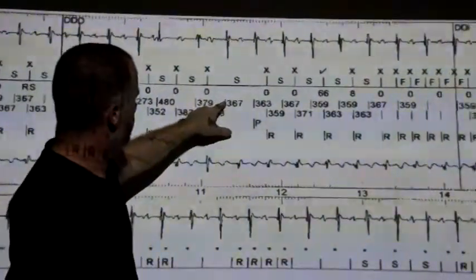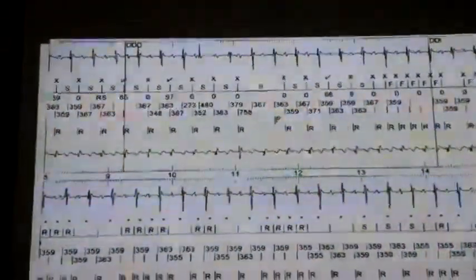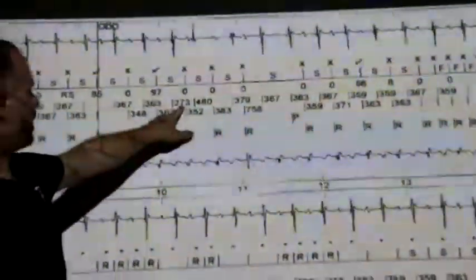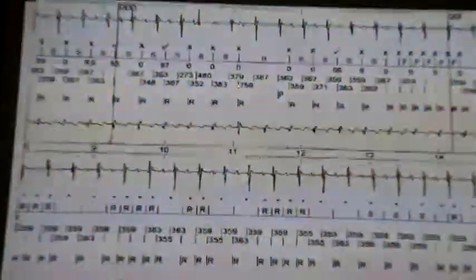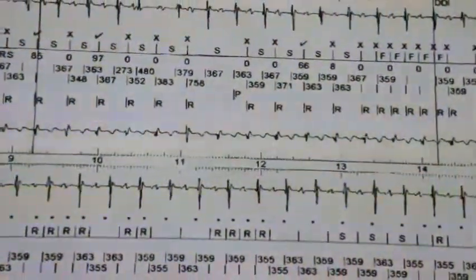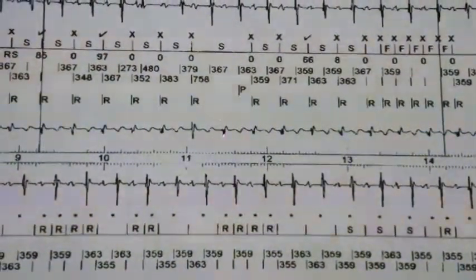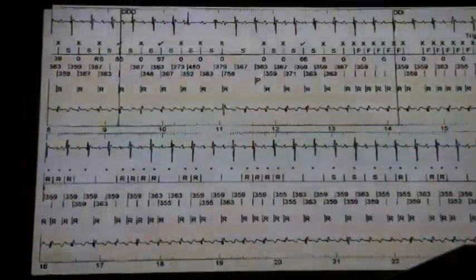So the numbers are the AA interval and the VV interval. Your early A was 273. The number precedes or is it after the marker? It's this number, it's 273. That's an early A. It's just an ectopic with a bit of wenckebach. A through the V. They didn't see the V. There's no V sense, right? There is a V. There it is. But the device doesn't see it. So actually atrially paced. Sorry, it didn't actually pace it.